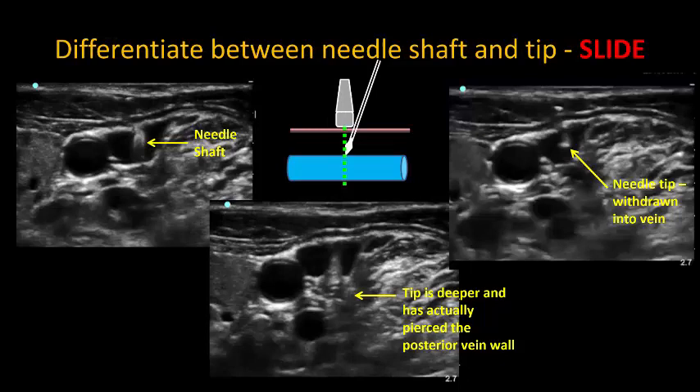Ideally, we would identify the tip earlier on in the process and slide the probe distally to track the advancing needle tip, to avoid going deeper than we intend.